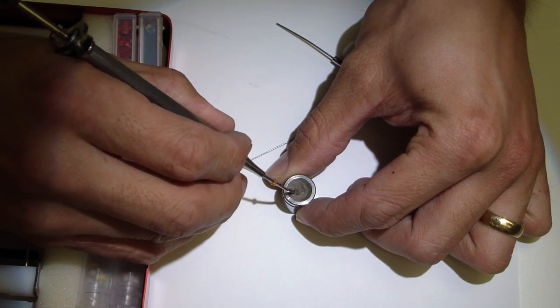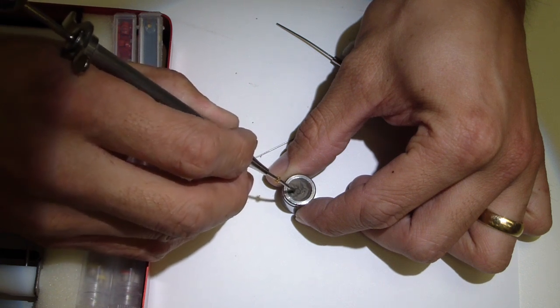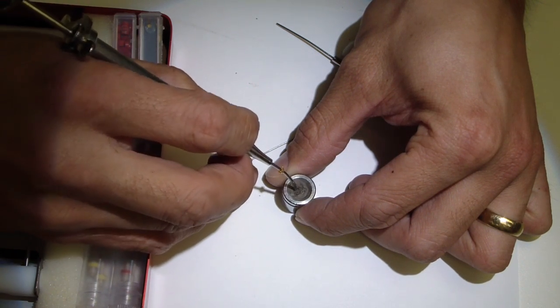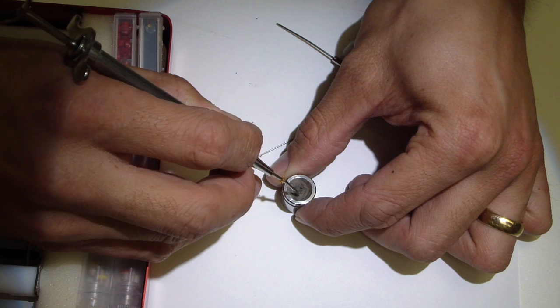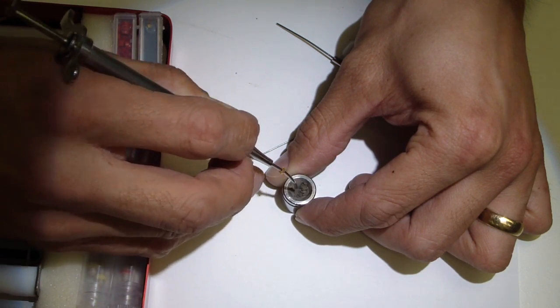Essentially the MTA is not too wet, not too dry. It's one of those, kind of got to go for a feel for it, and it's like loading an amalgam carrier. This has dried out in the last two minutes.